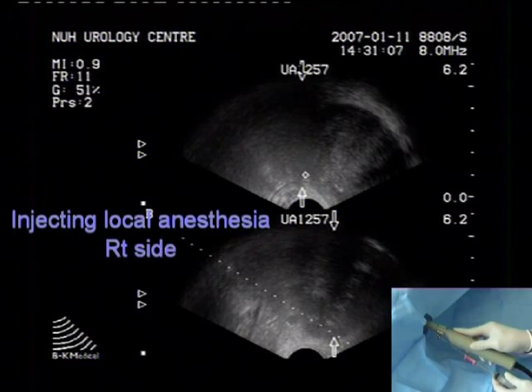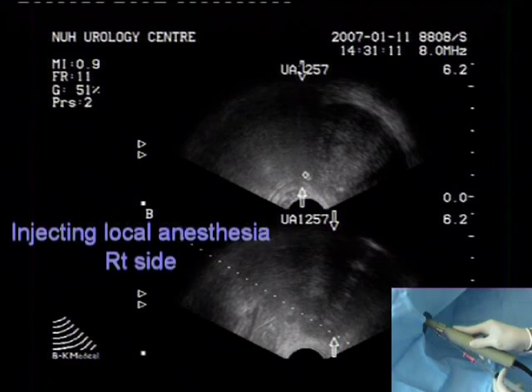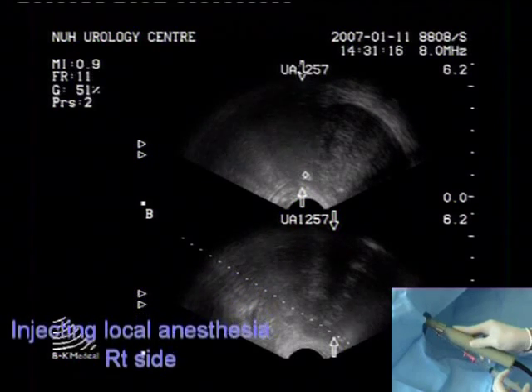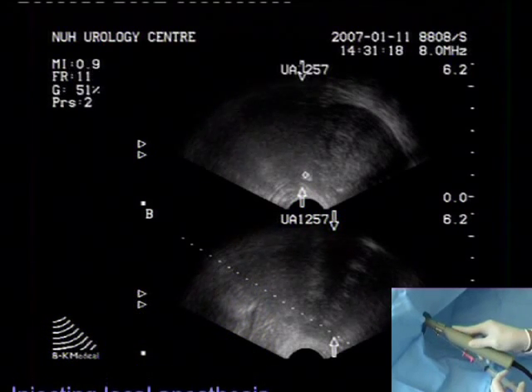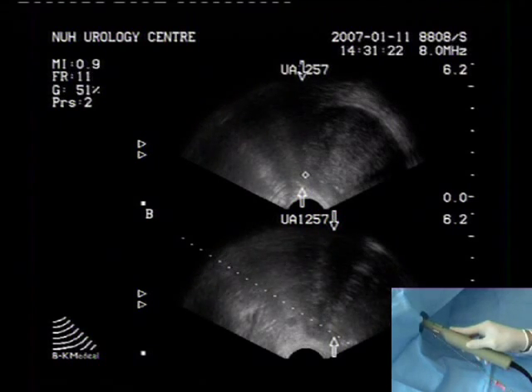The syringe is aspirated before injection to ensure that a vascular structure has not been entered. We then infiltrate the neurovascular bundle on each side with 5 ml of 1% lignocaine using the outer sheath of the biopsy needle.